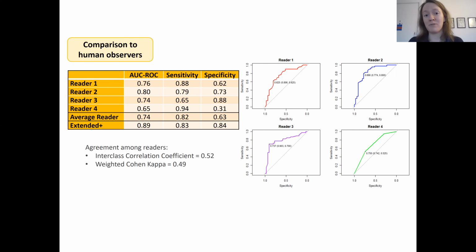And so this provided not only a security for our state of mind in that the machine learning is providing something that the reader just isn't able to pick up on, but actually we were able to have conversations with these radiologists and pulmonologists and get them more on board with being able to have this sort of tool that would provide an additional indication, that based off of these features, it's most likely to be fungal infection.